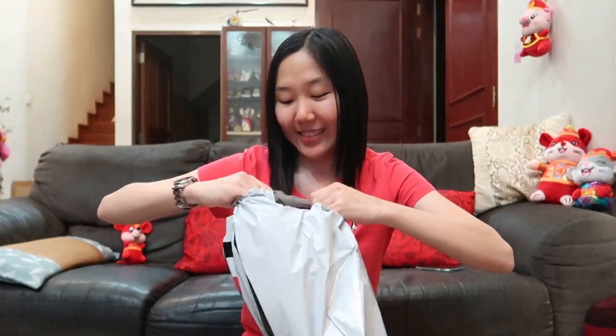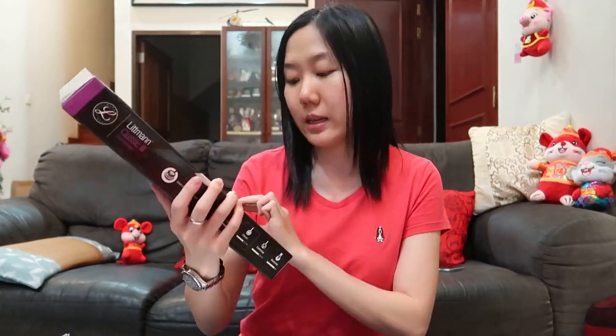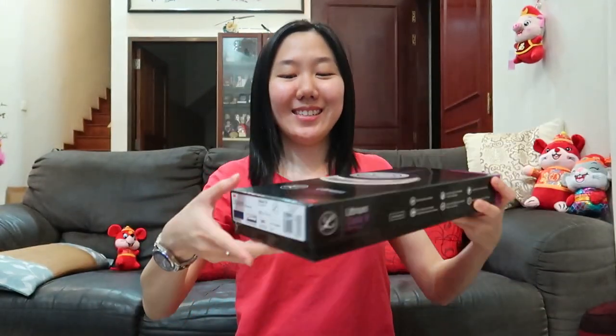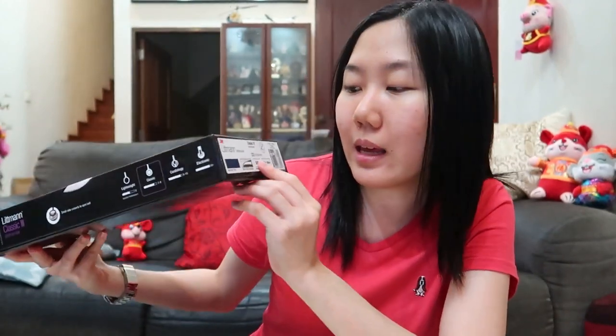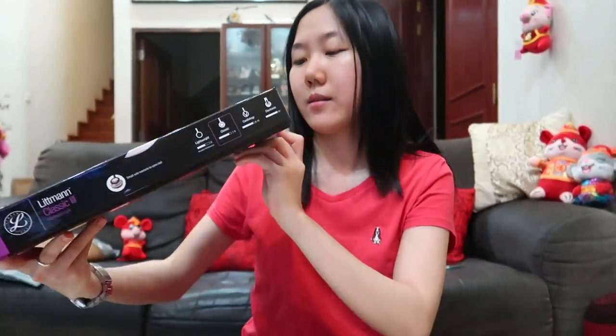Can you guess what color I got for my stethoscope? This is my stethoscope — it is the Littmann Classic 3. On the side of the box they have a few labels: the color, the mirror finish chest piece, and the catalog number. The catalog number for this color and design is 5863 and the length is 27 inches.